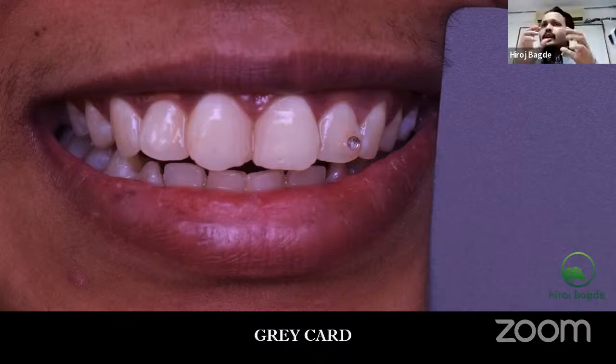A gray card will definitely be the most standardized card for us to transfer the color settings from one camera to the lab, where he will check the shade and guide accordingly according to the gray card. So I will have those gray cards to be used. I will not go into details now.